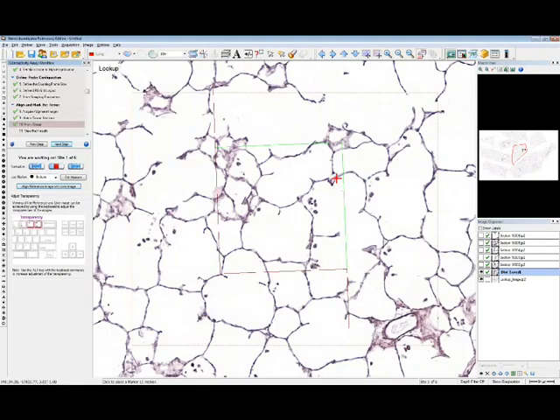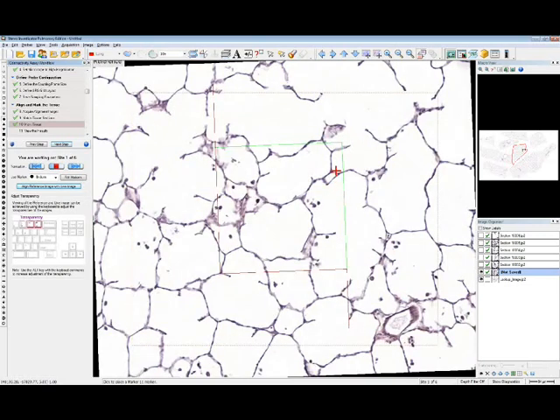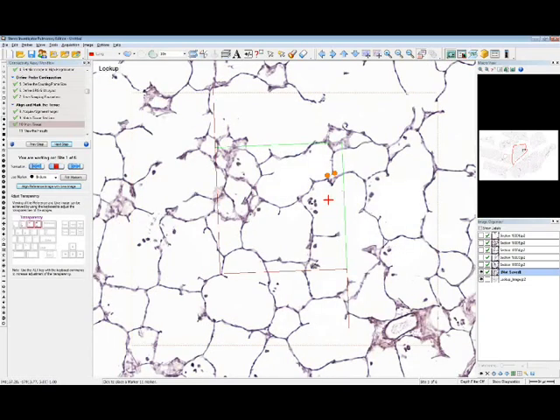So over here, we can see that we had no connection. You'll see where my mouse is over here, there's an empty spot, and there's an empty spot on the other side of this little structure. And if I go to my reference, now I have these two connect. That means I can mark two bridges right here.